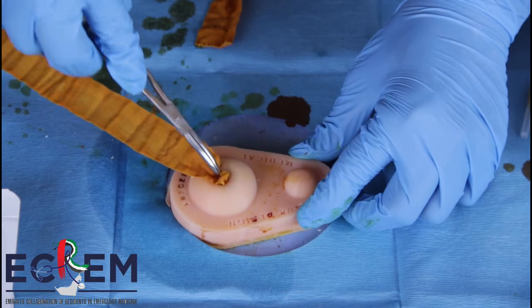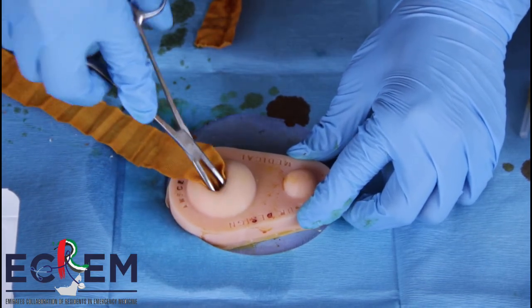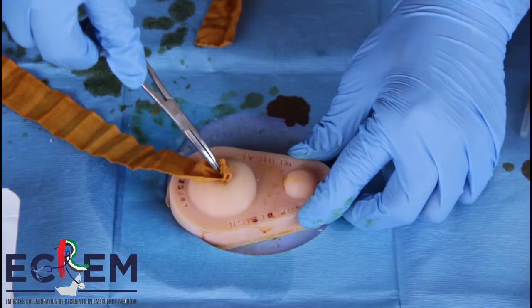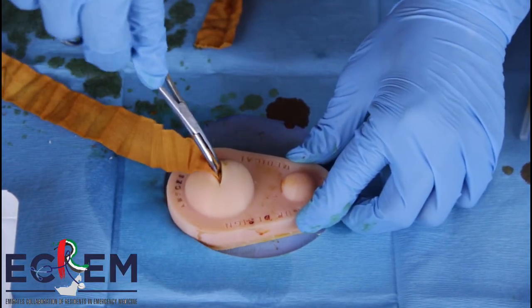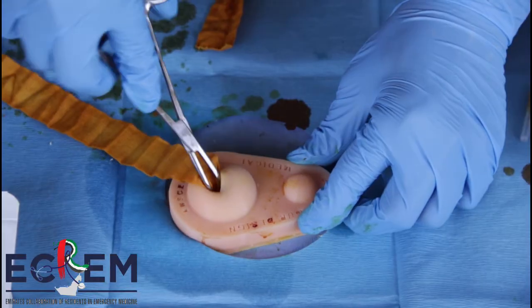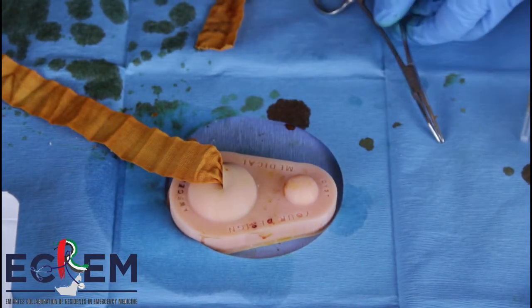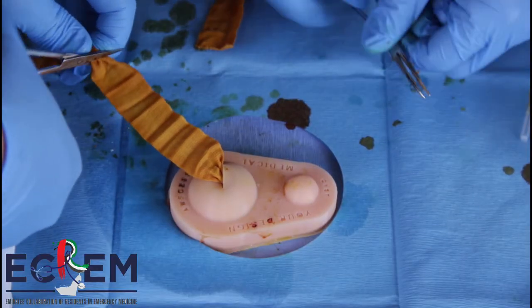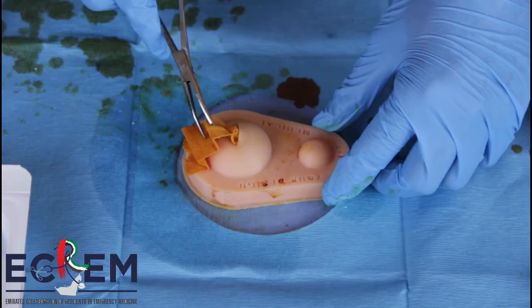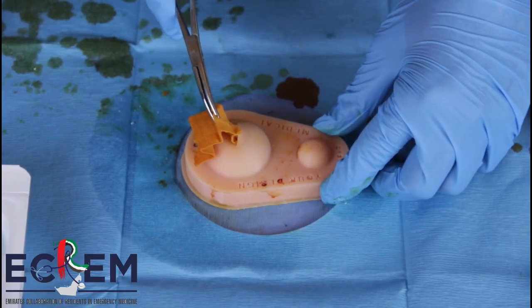I keep going in. Now I'm fully in so I will just cut the remaining part. As you can see, I've left a couple of centimeters outside so that it can be removed easily.